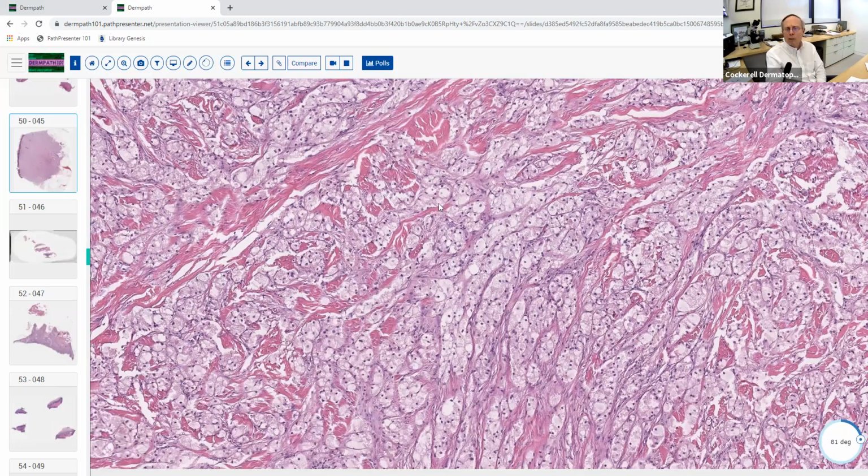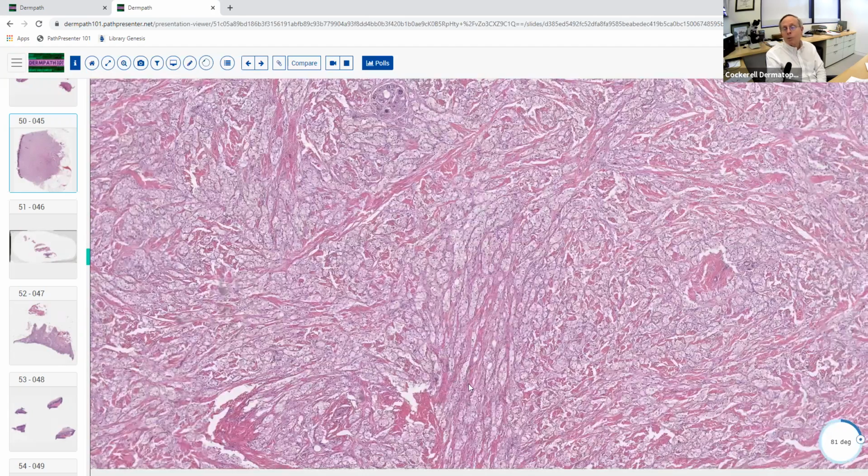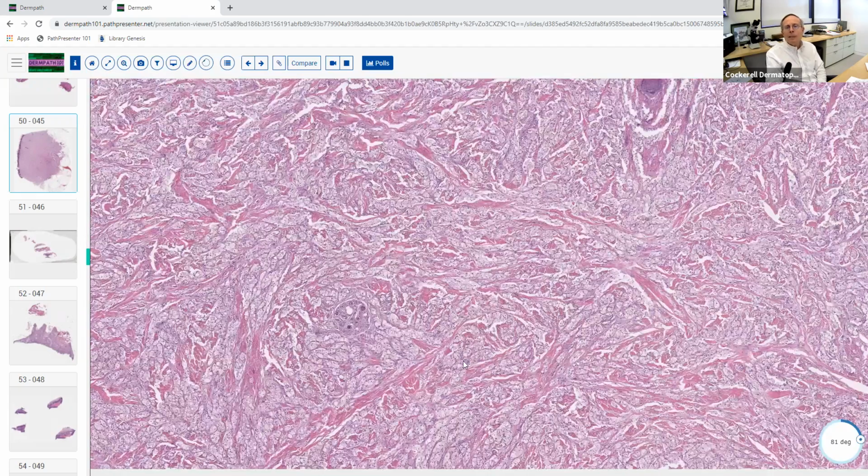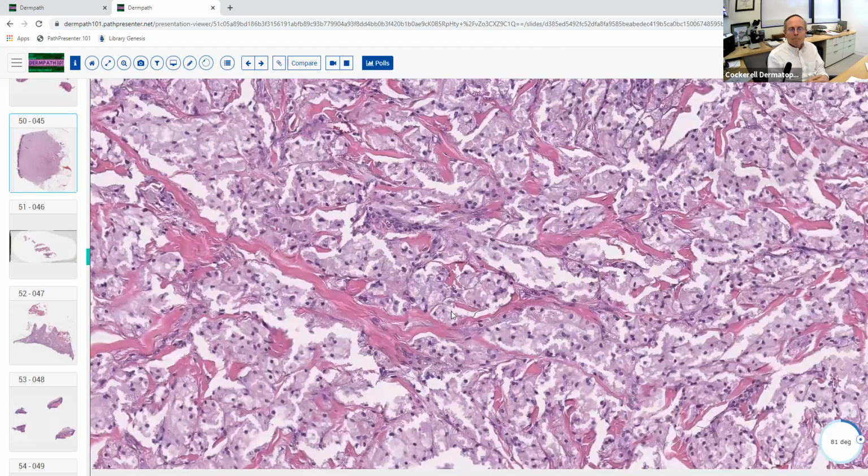Well, it's one of the neurocristopathies. It's in the family of Schwannian differentiation. So it's really a neural neoplasm. And basically what happens is the myelin breakdown products, the lysosomes engulf these things and they get chock full, and it forms this granular cell morphology to the cell. So these are abortive cells attempting to form Schwann cells. So they're abnormal Schwann cells is a way to think about it.